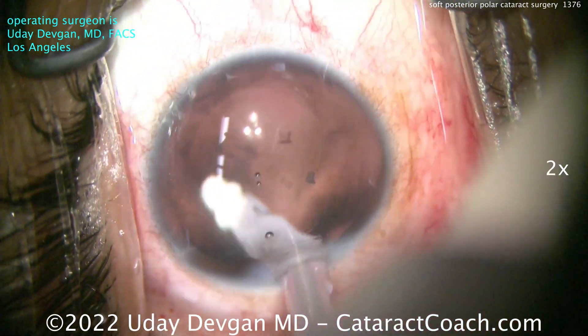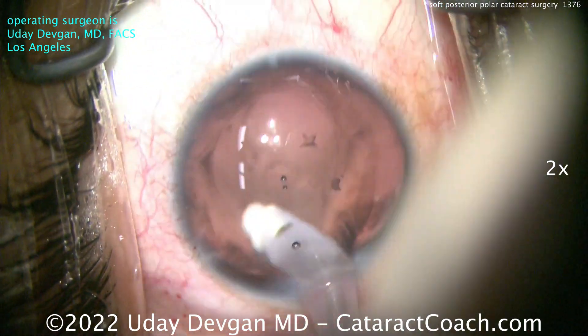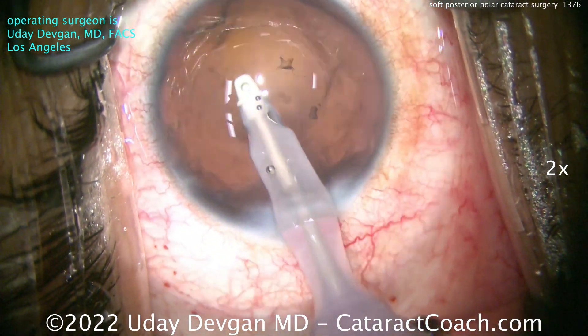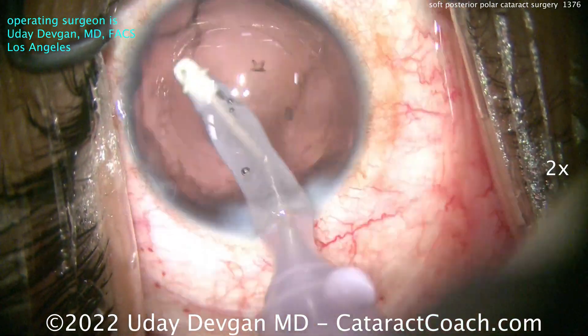Now there's a balance in this case. We know there's a defect in the posterior capsule — the capsule can be fragile, weak, or even frankly absent in certain spots. So you've got to be very, very cautious in these cases. As a young patient, you want a beautiful outcome for life.